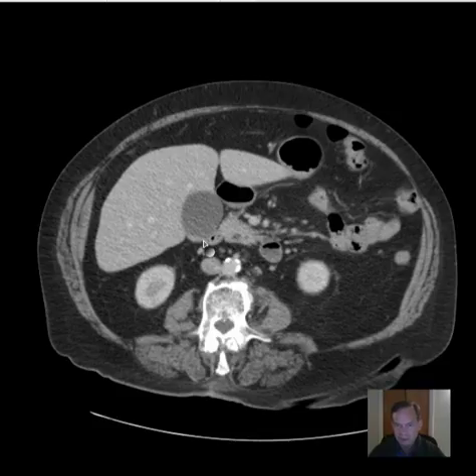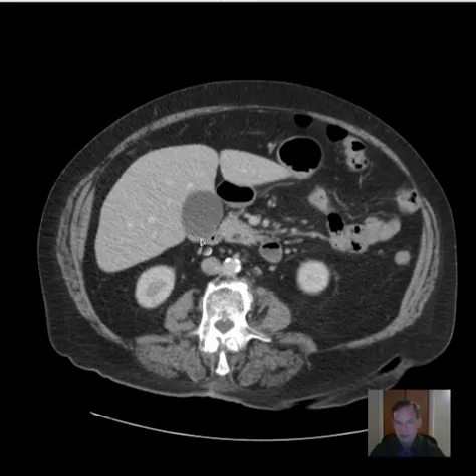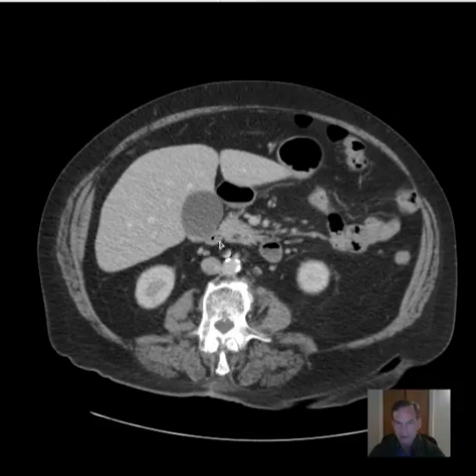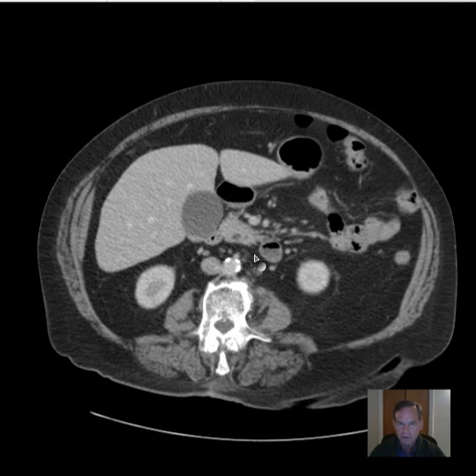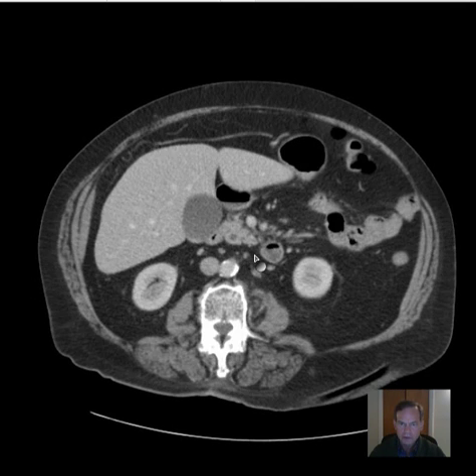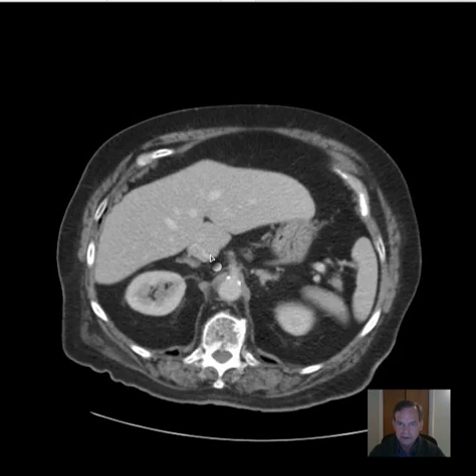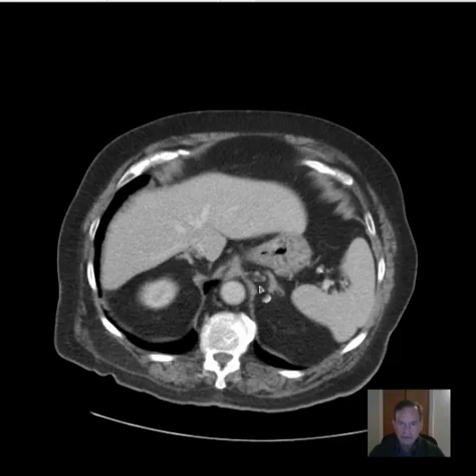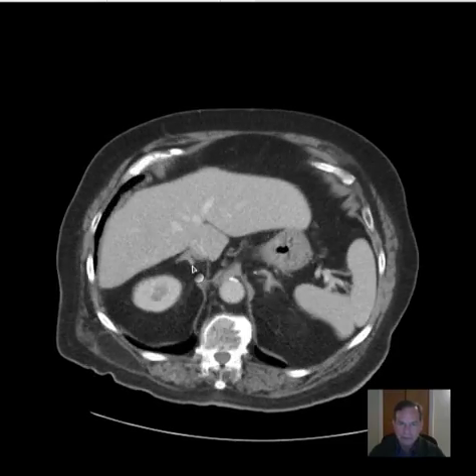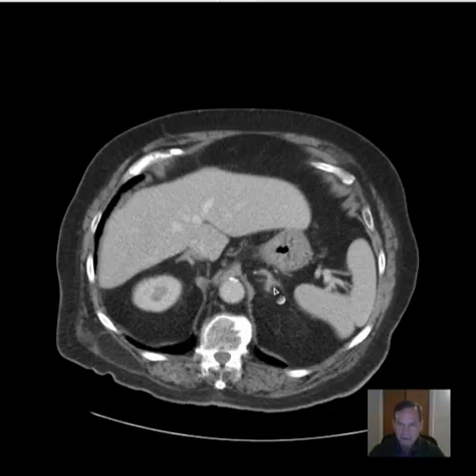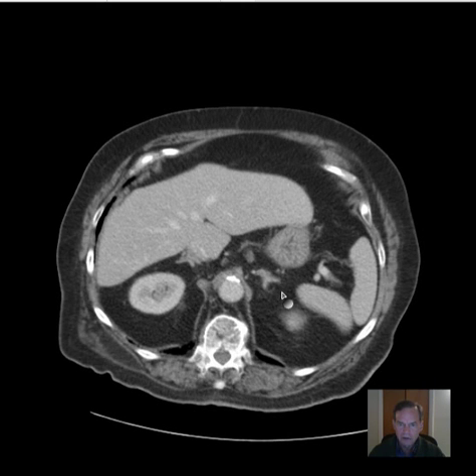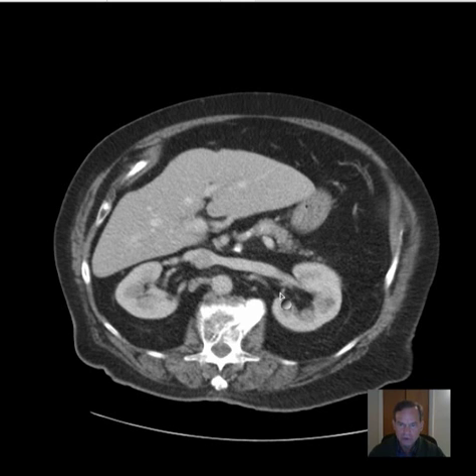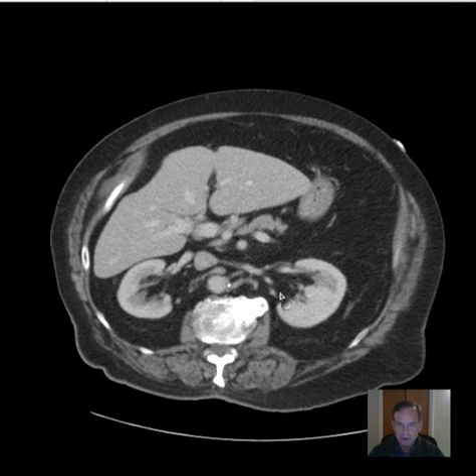Gallbladder - I see some very faint high attenuation structures in the dependent aspect which are very suspicious for gallstones. Here is the gallbladder, and this slightly whiter, higher attenuation area in the dependent aspect is very suspicious for gallstones. The adrenal glands - here is the right adrenal gland, shaped like an upside-down V, and on the left more like an upside-down Y. So probably small stones in the gallbladder; adrenal glands appear unremarkable.